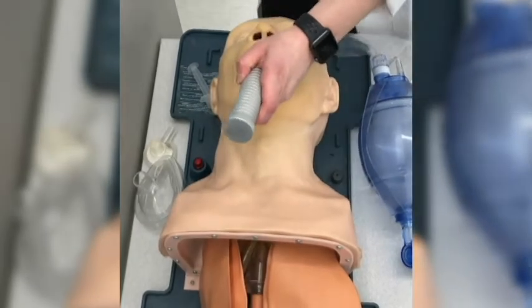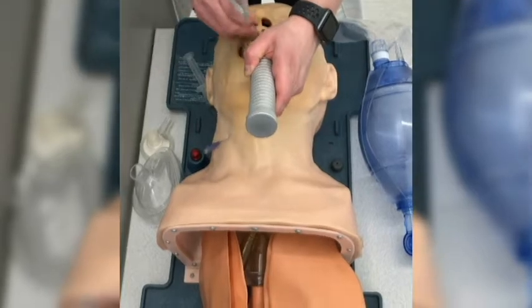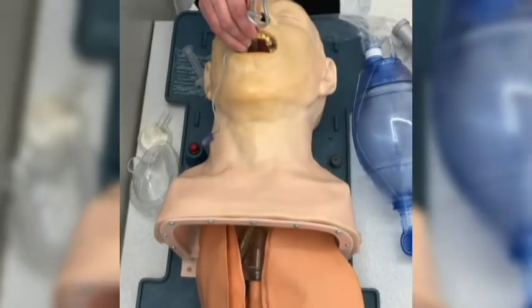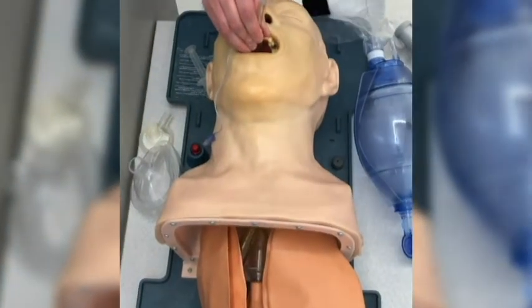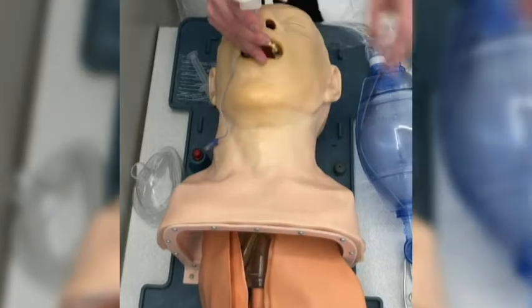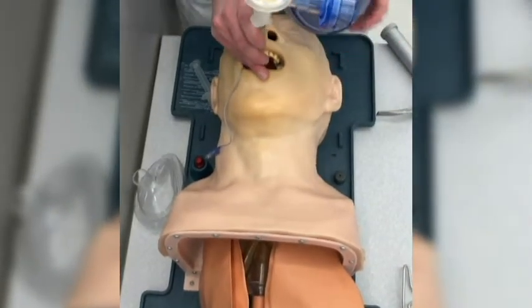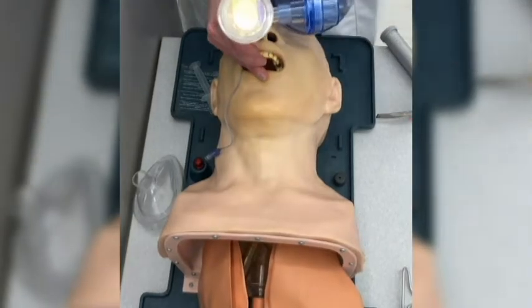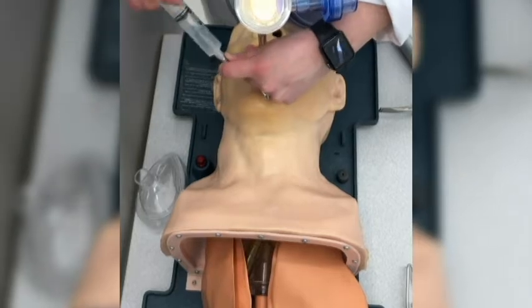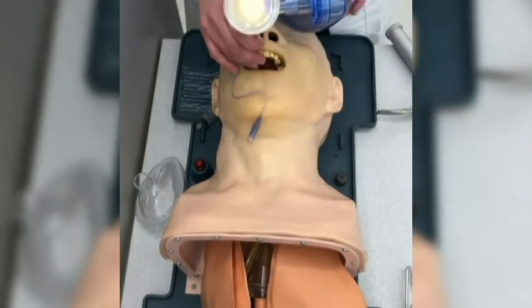We put something called the laryngoscope into their mouth. Our breathing tube is then passed and placed in the patient's airway. We hold onto the tube, pull out what we call the stylet, which basically holds the shape of the tube. We put on something called an End-Tidal CO2 Detector, which tells us if we're in the lungs. If it turns yellow, yellow means yes, so we're in. And then we also inflate the little balloon that is around the tube, which is called the cuff, so that nothing from in their mouth falls down into their lungs.